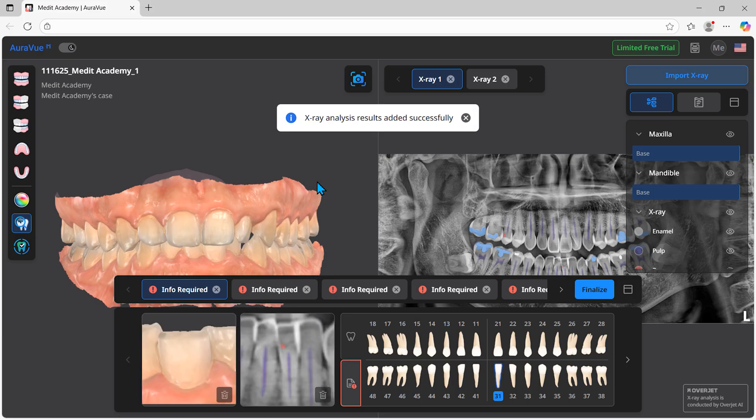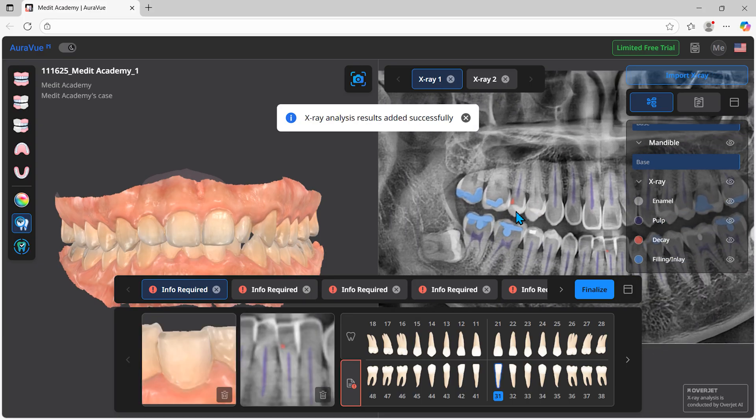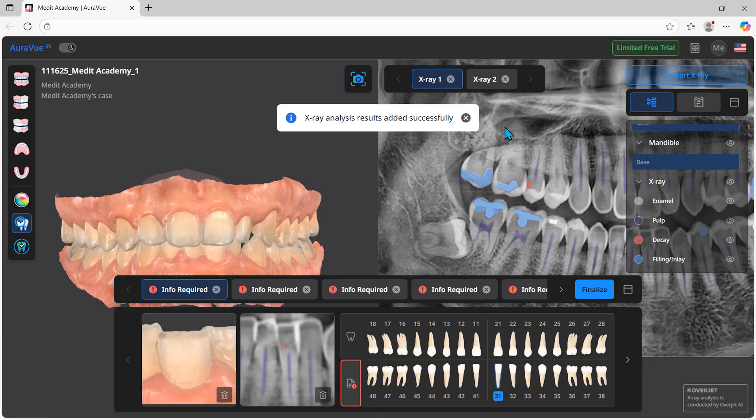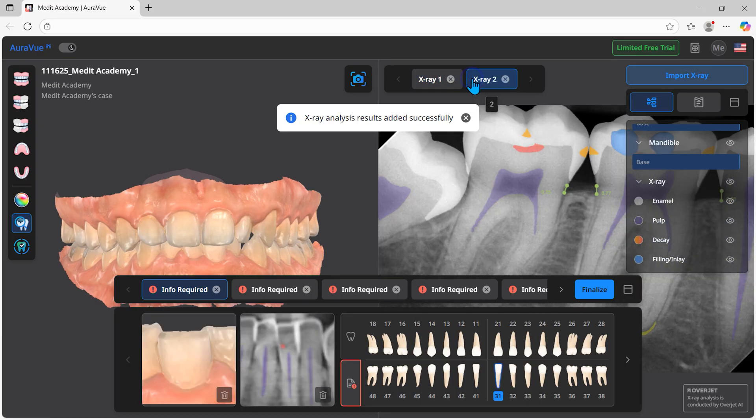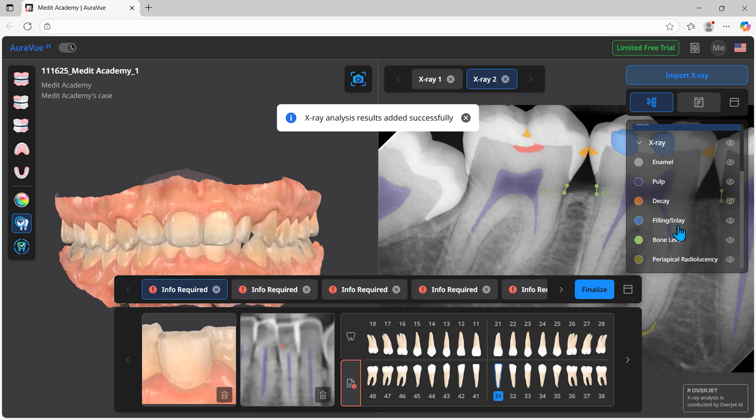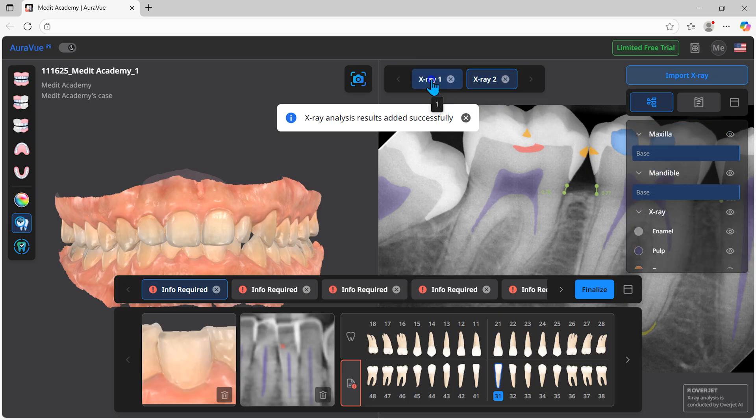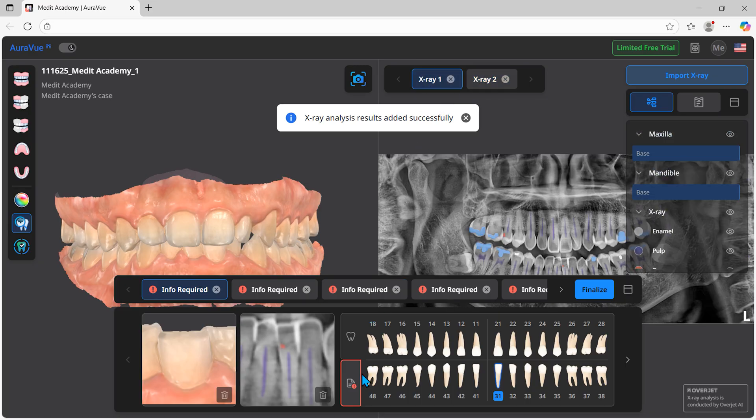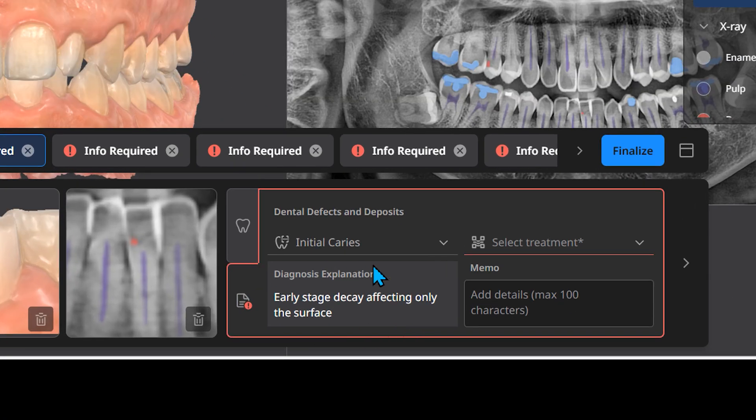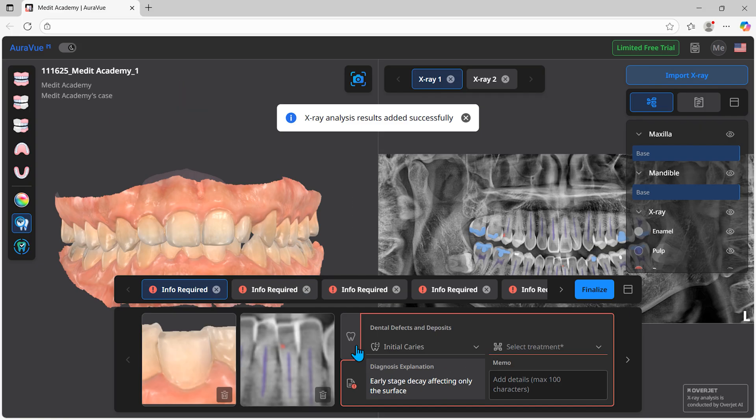Overjet's FDA-cleared AI diagnostic technology analyzes the images and visually highlights key diagnostic points. Areas of concern like decay, calculus, attrition, and missing teeth are detected and generated into a patient report.